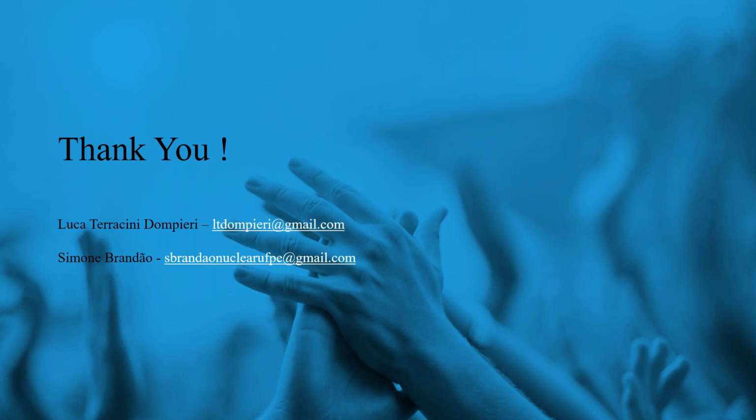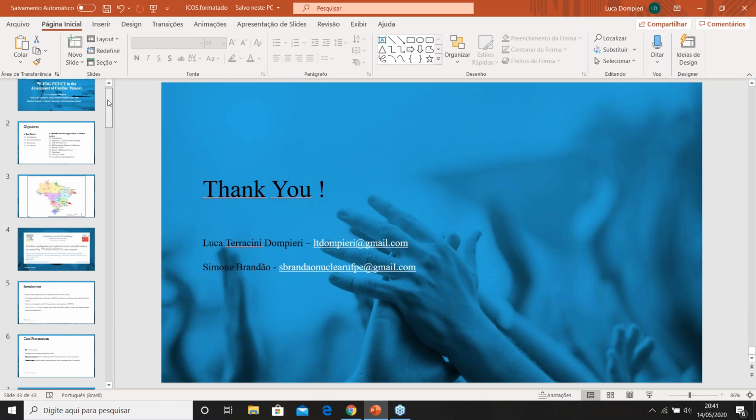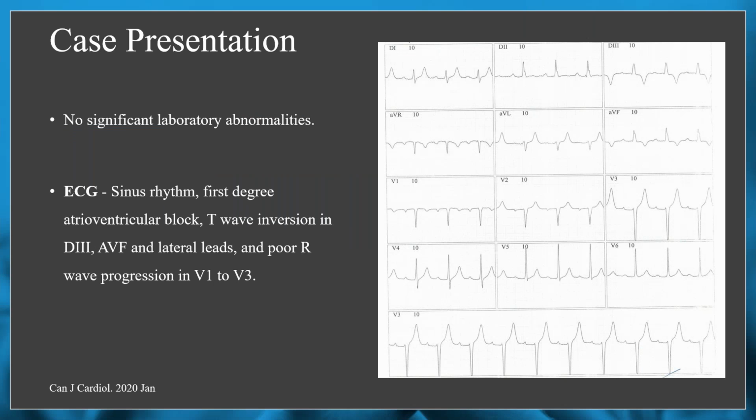And maybe you should go back to more cases and see if that pattern is something that's constant in the tumors that you've seen. Because it really is an unusual presentation. And maybe it's a clue that there is some infiltrative disease there that we didn't think of before.